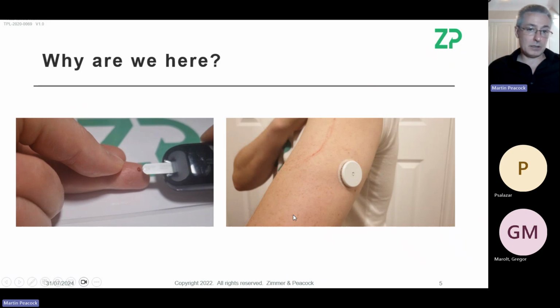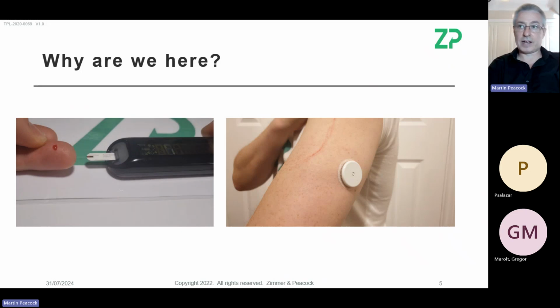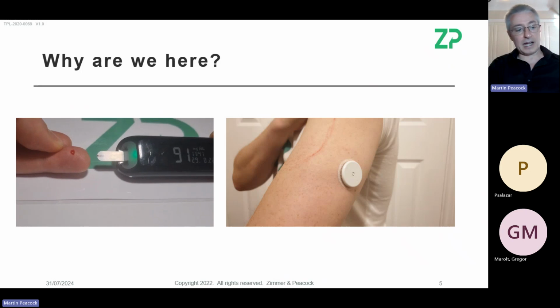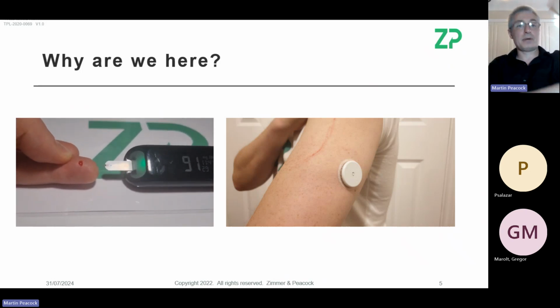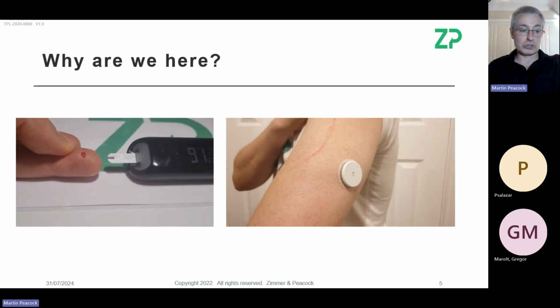And very similar science has been translated into these wearable sensors. In fact, there was a company in Alameda, California called TheraSense. It's now part of Abbott. The IP behind TheraSense came from a guy called Adam Heller. The first product that TheraSense actually put on the market was a glucose strip.